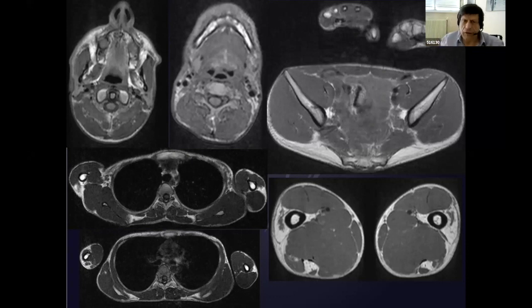So with artificial intelligence, you can put a lot of things into the black box and have a lot of information, not based on muscle alone.